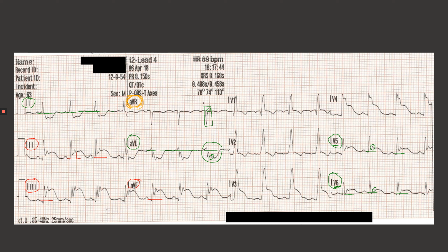We have to do RV4 in order to figure that out. But note that later because you will need to do RV4s here. But it's in 2 of them, at least 2 of them. We have it in more, but because it's in 2 of them, that's contiguous. So that is signs of STEMI. That is signs of an MI. I would call the STEMI line for this.